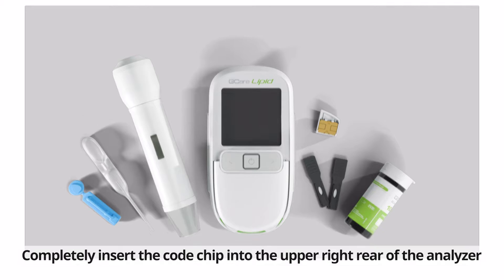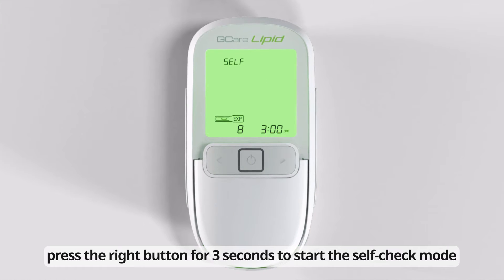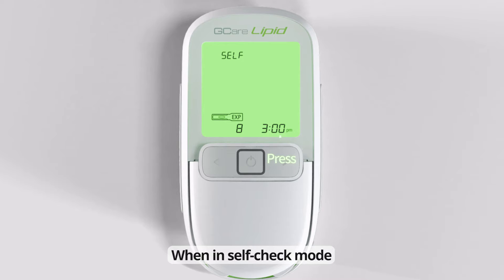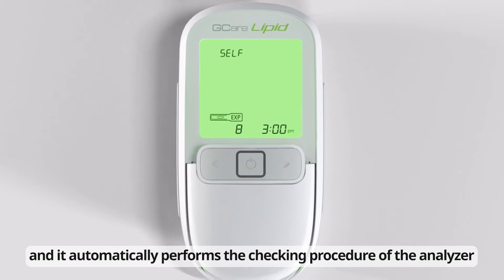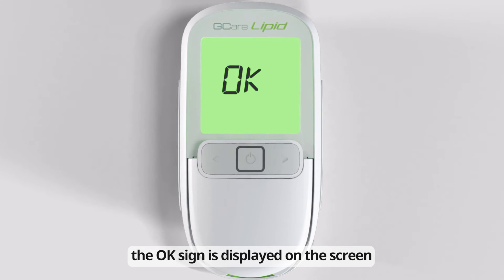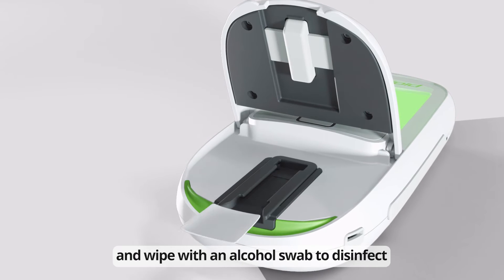Completely insert the code chip into the upper right rear of the analyzer. When the initial screen is on, press the right button for three seconds to start the self-check mode. The self-check mode activation appears in the upper left corner and it automatically performs the checking procedure. Once the self-check is successfully completed, the OK sign is displayed on the screen. Check for foreign substances in the strip guide insertion slot and cover, and wipe with an alcohol swab to disinfect.